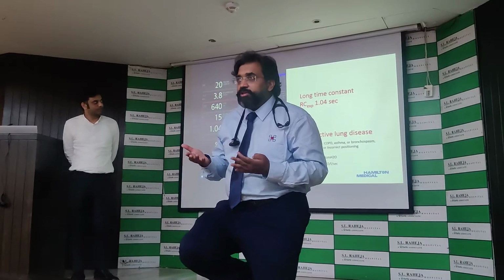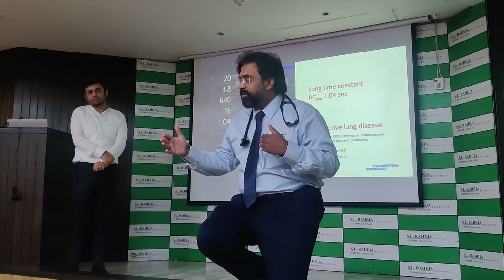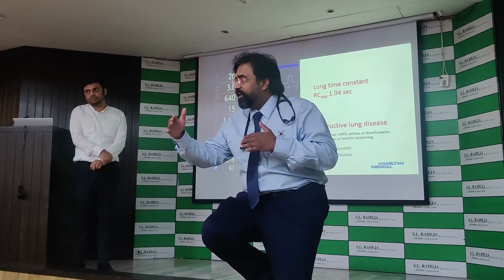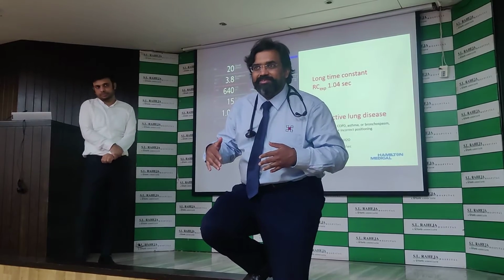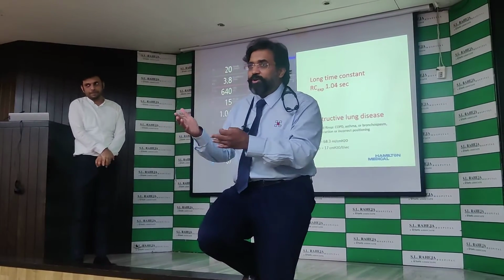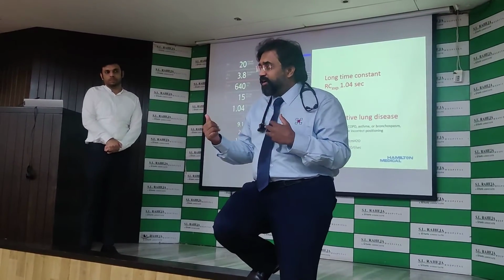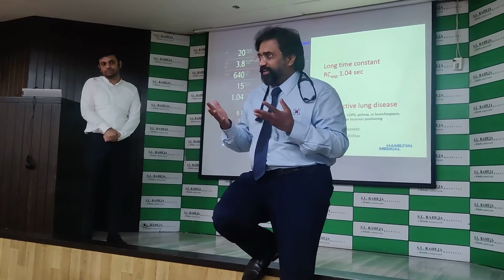Take the example that the patient is in obstructive airway disease. He's got a bigger volume, so he's going to take a longer time to fill. So my inspiratory time has to be high, and my expiratory time also is going to be high, because it is going to take a longer time to empty also. In fact, it will take even longer to empty because it's passive, active versus passive. Whereas when it is a restrictive lung disease, your time constants become smaller. So the I:E ratio and RR will change accordingly.